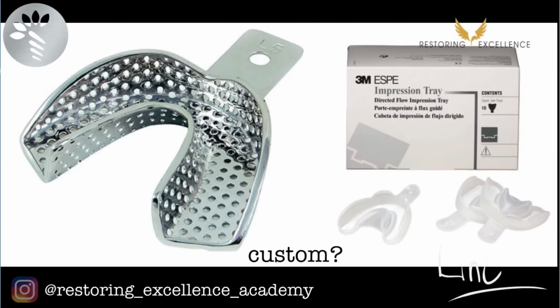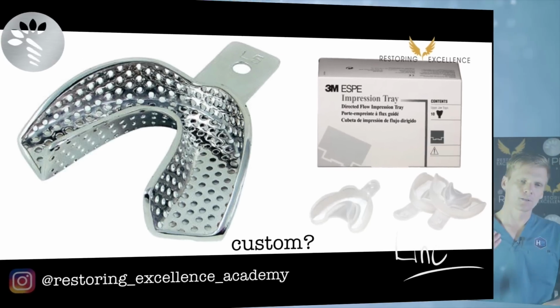But never ever get a solid metal tray stuck in the mouth. Okay, I've cut a metal tray out of the mouth and it takes 45 minutes with a tungsten carbide and it's extremely stressful for both you and the patient, and heaven help you if they're a gagger who vomits. Okay, you would probably retire from dentistry immediately and take up painting toenails or something.